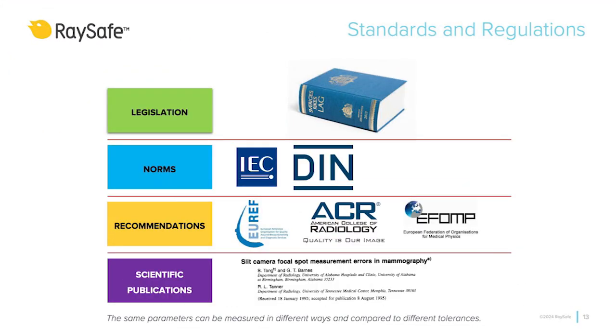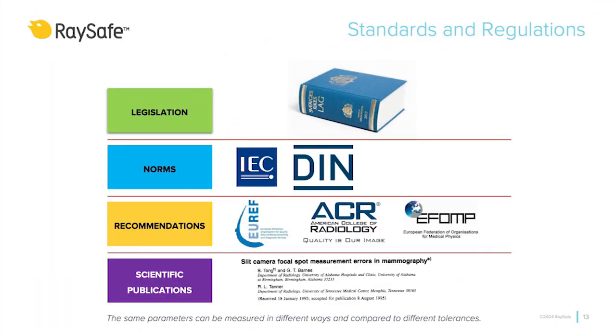When ensuring quality assurance and using phantoms for testing, we follow various norms, standards, and recommendations. Key organizations like the AAPM or the IEC provide these guidelines. They offer detailed instructions on using phantoms to calibrate and assess imaging devices. These standards ensure procedures can be reliably replicated across different settings, maintaining consistency in imaging quality.